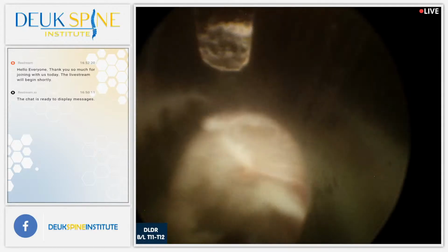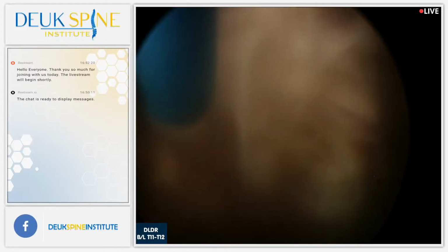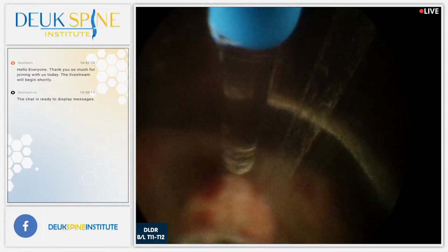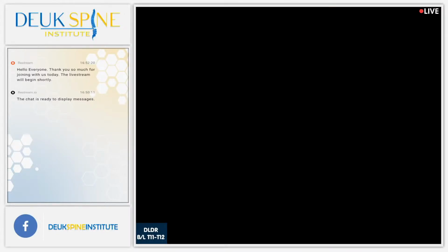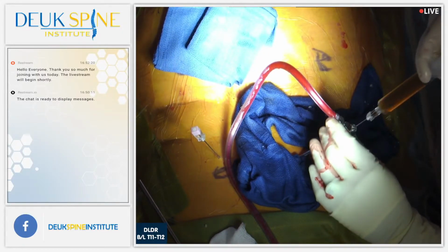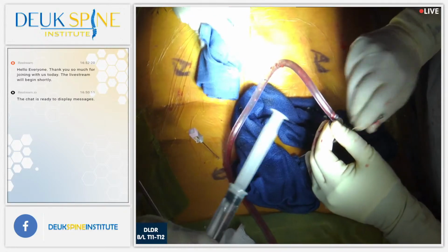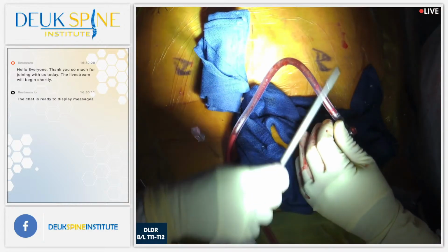That's the epidural. There's the end right there of the disc. I can just get this last bit and that's really it. All right, there's the fat in the epidural space. Two on, please. Thank you. Irrigation. This is clogged, I think, maybe. Come on, Luis. Come on.